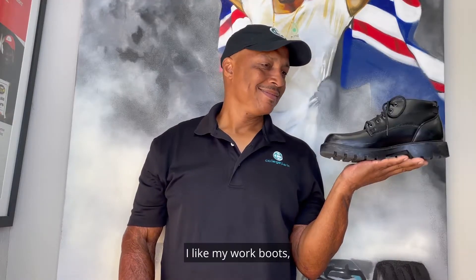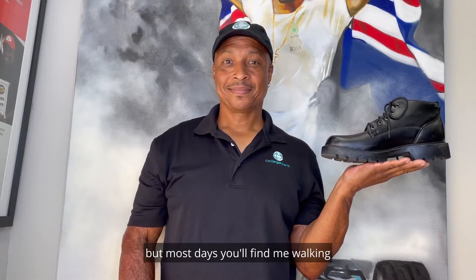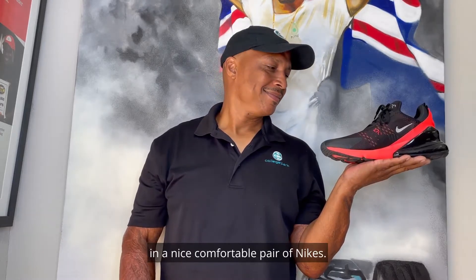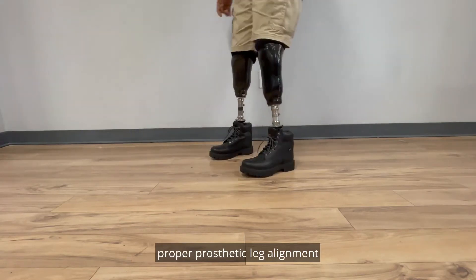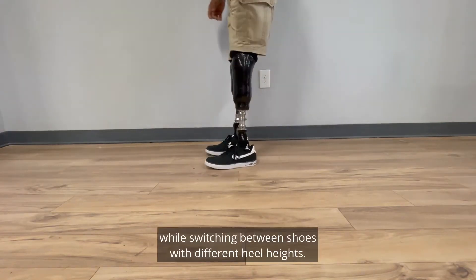Here's my problem. I like my Chucks. I like my work boots, but most days you'll find me walking in a nice, comfortable pair of Nikes. Over the years, I've struggled with maintaining proper prosthetic leg alignment while switching between shoes with different heel heights.